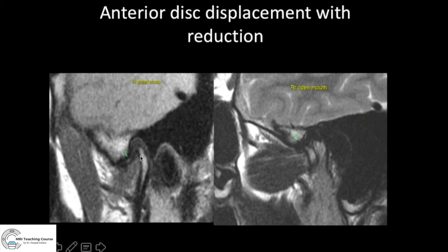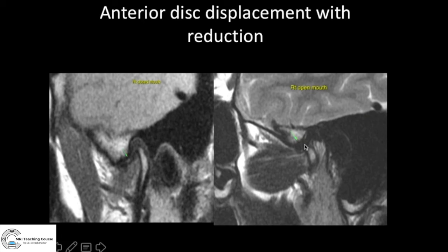In this closed mouth position, you can see the mandibular condyle and the disc is obviously dislocated anteriorly — there is disc displacement. The next question is: what happens on open mouth? Does the disc return to its normal position with the mandibular condyle? Here in the open mouth position, the disc shows a normal relation to the mandibular condyle. So this is anterior disc displacement with reduction — displaced in closed mouth, regained normal position in open mouth, because the retrodiscal tissue is still maintained. This is considered minor derangement.